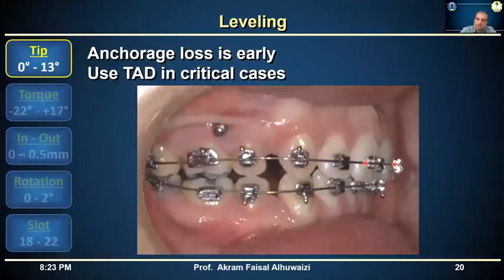And you find that, oh, I've got a bimaxillary proclination in the patient who started off with rather flat teeth. That's because you're using high tip brackets, which are generally Roth brackets. So you either use MBT brackets, or I would prefer you put a TAD and anchor the canine. Or the simplest form is just to use a lace back, but it is less effective.